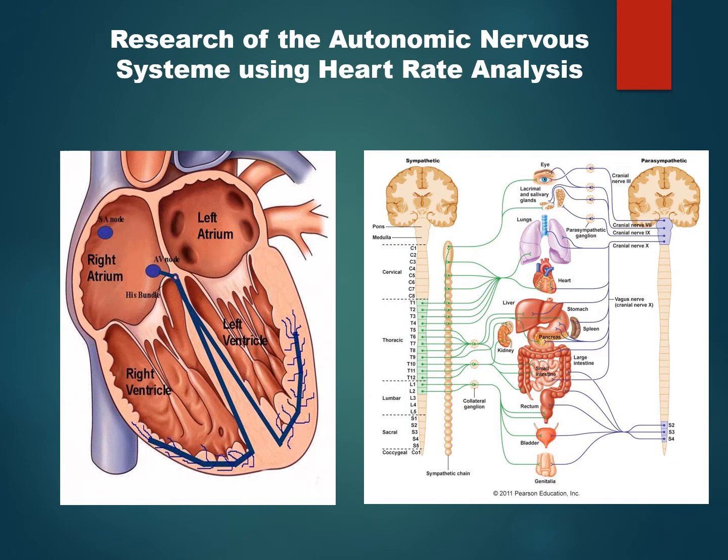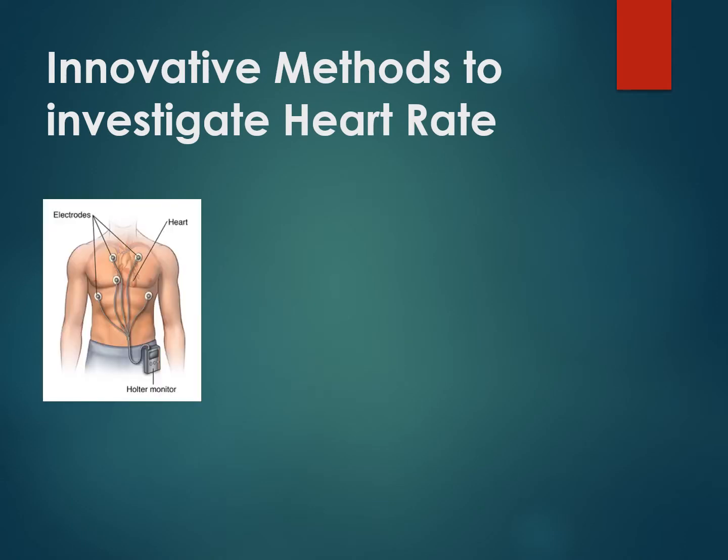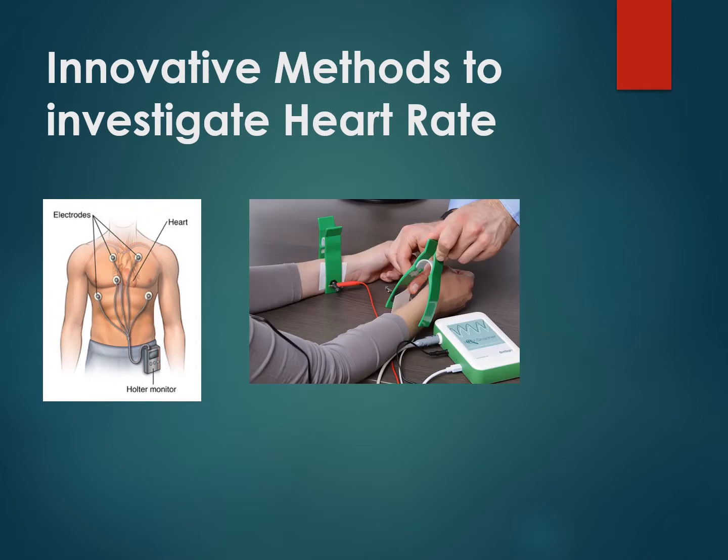For this research, we analyzed the heart rate and heart rate variability generated in the sinus node. In my first video, I show how to analyze heart rate variability using a 24-hour Holter ECG. Now, I will explain how to perform autonomic diagnostics with the active standing test using the Biosign device.